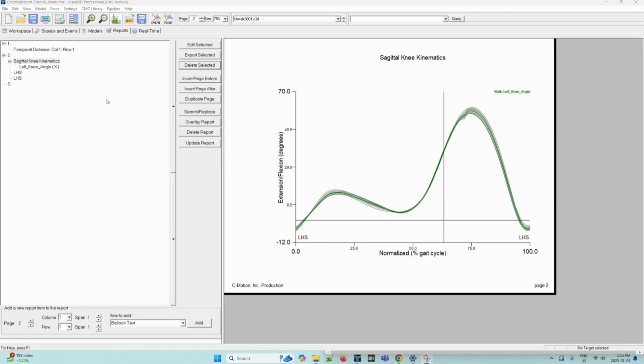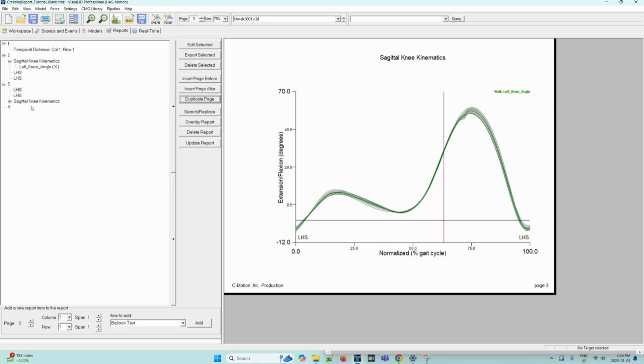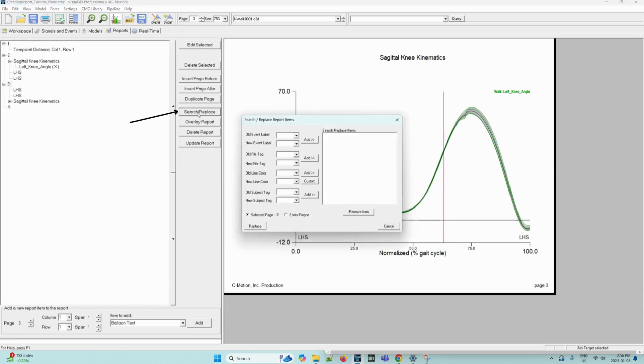First, we can create a copy of the current page by using the duplicate page button here. Now that it has been duplicated, we can go to the duplicated page. So we can select page number three and then select the search and replace button to open the options. From within this dialog box, we can select the old file tag or old event label and the event or tag to replace it and then click add. This will automatically replace the old event or tag and replace it with a new one.